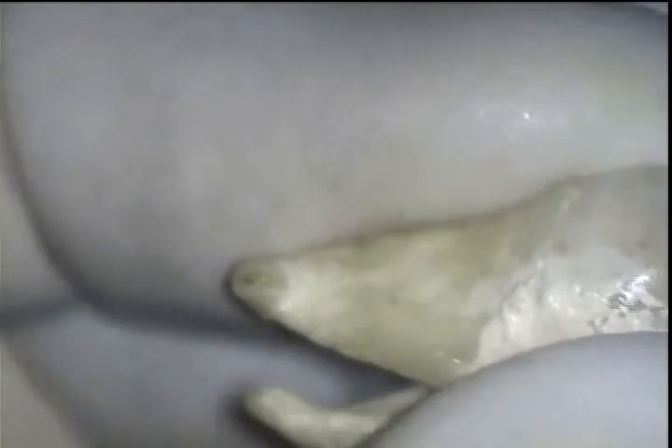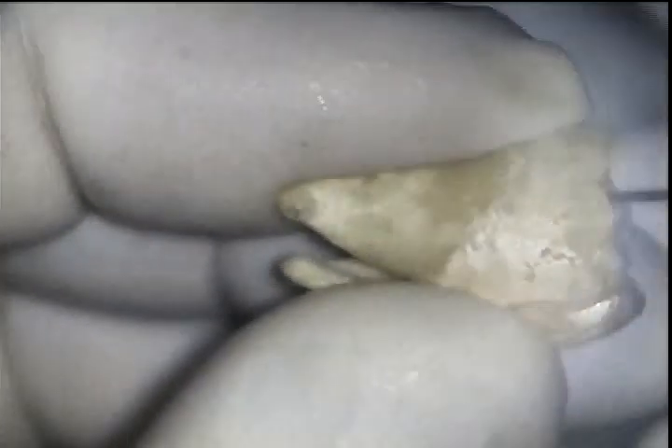I've oriented the distal root so you can see the apical negotiation around the curve with the 08 reamer. This was only possible by bending the instrument at the tip, finding my way down the tortuous root, and once there using a series of short manual strokes, followed by longer strokes while trying not to lose length. If the canal was patent with the short strokes and I lost length with the long strokes, I proceeded to the next instrument.